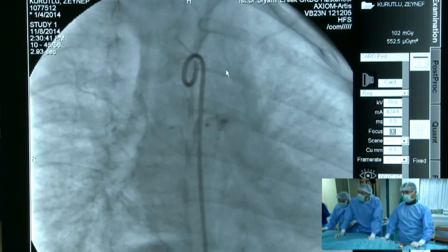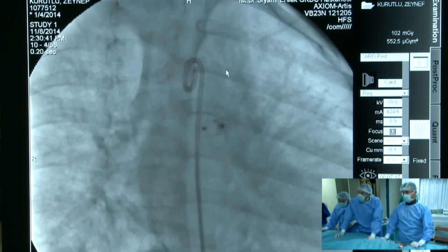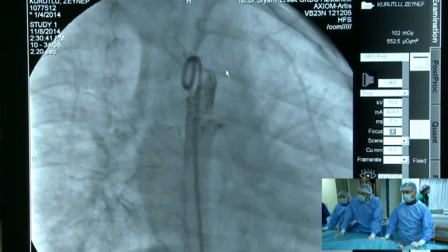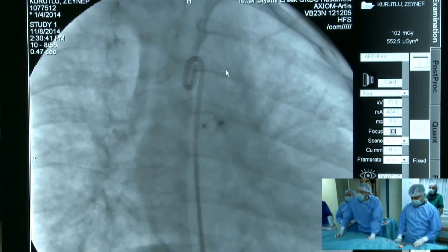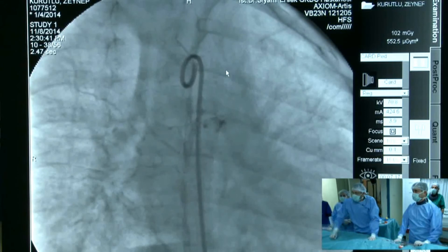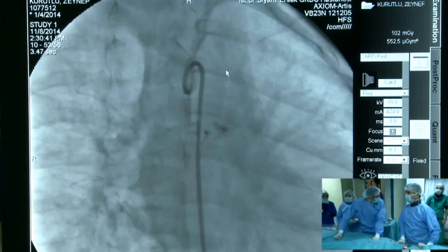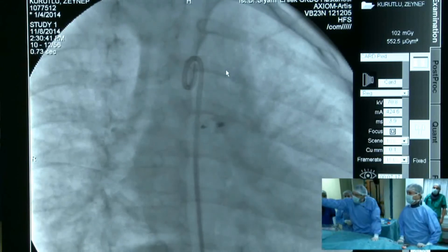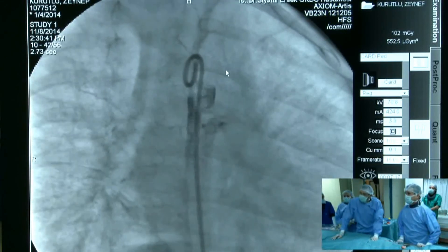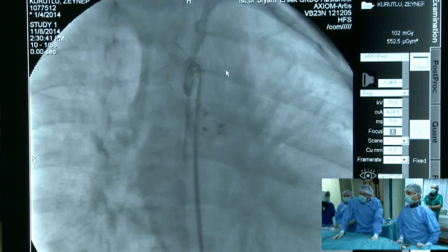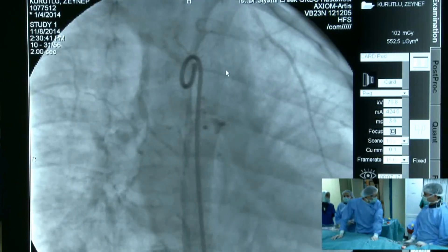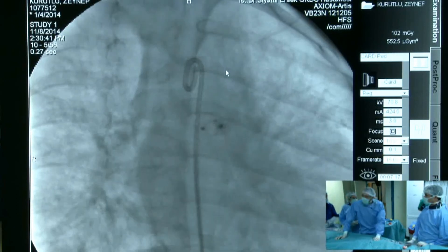It is a perfect result and we congratulate the team. There is one small question — I think there is no need to close the small AP collateral. No, no, no — we agree.